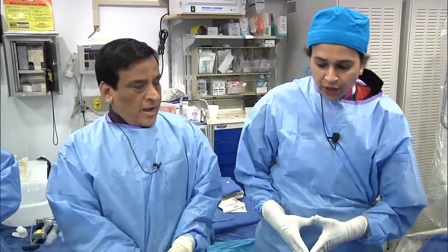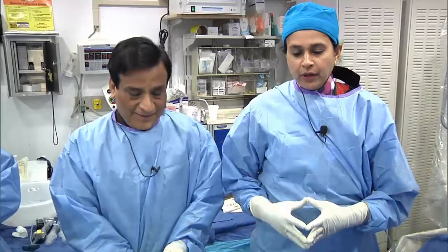Right. What I say right now, what we have created is artery in pieces, AIP. We have created an artery in pieces, but that doesn't mean the entire LAD will heal now. What we did not do, or what would have been the wrong thing to do, was probably go and dilate that. If you had dilated, then we would have created a bigger subintimal tract, more hematoma, and then getting into the true lumen.